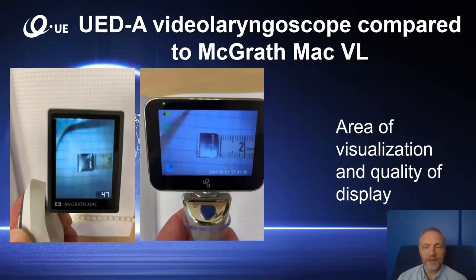Another interesting thing is the area of visualization and quality of display. On this slide, you have the comparison of the monitor displays of those video laryngoscopes. At first look, you can see that there's a difference between them regarding the area that is visualized during the observation of the entrance to the larynx and surrounding tissues and structures.